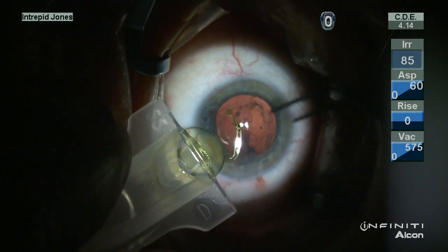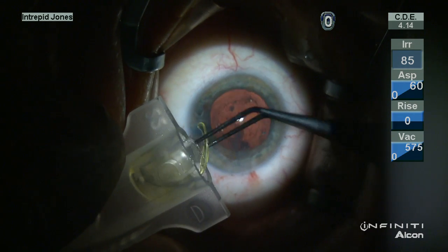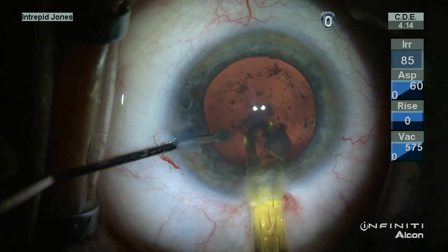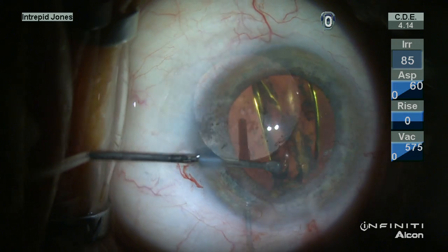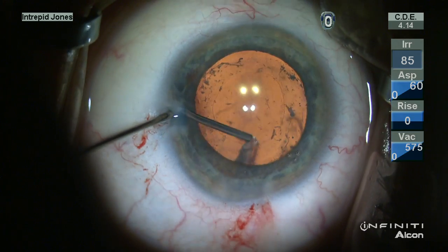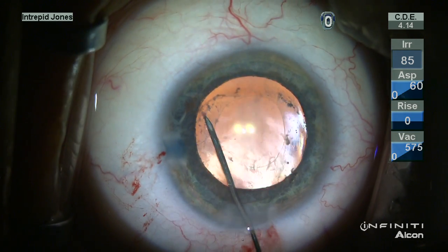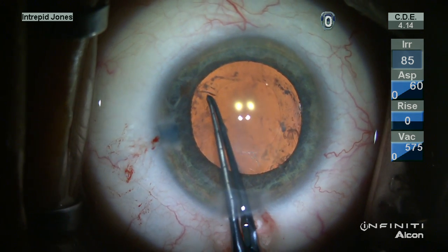The intraocular lens is folded into the injector cartridge and then placed into the capsule bag. Additional viscoelastic helps provide extra space to allow evacuation of some additional sub-incisional peripheral cortical material.